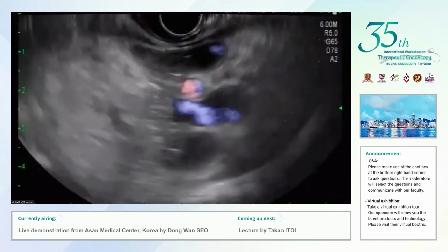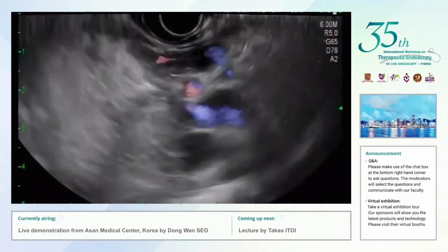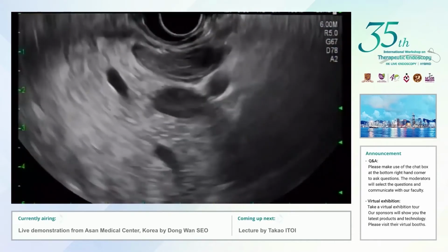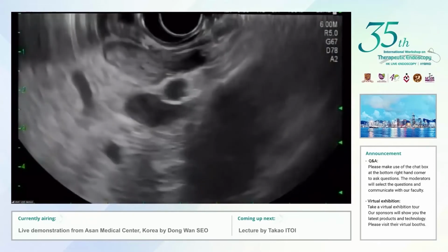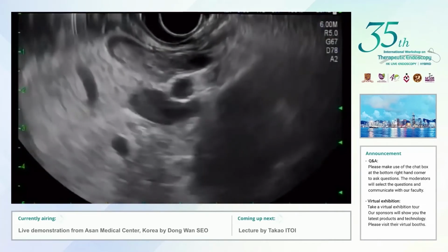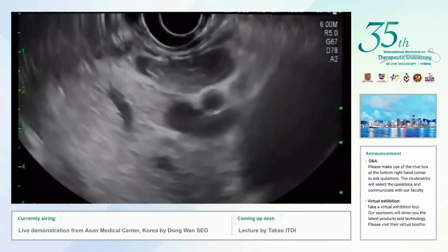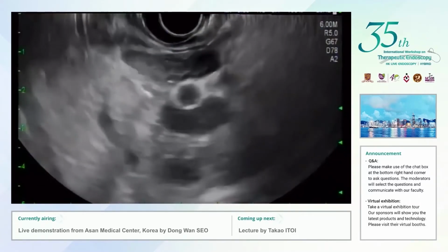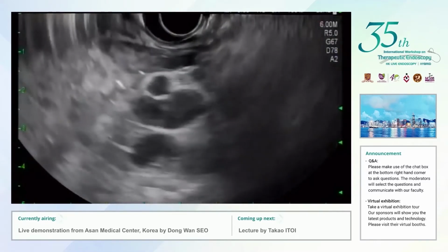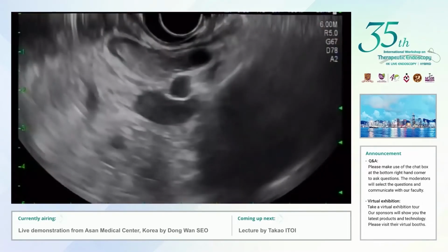What is the result of this biopsy that you have done in recent years? Is it increasing your diagnostic yield significantly? Yes, of course. We can get confidence in our differential diagnosis. Before Moray forceps biopsy, when we analyzed our data, I cannot remember the exact percentage, but a significant percentage actually changed our therapeutic strategy because of this biopsy result.